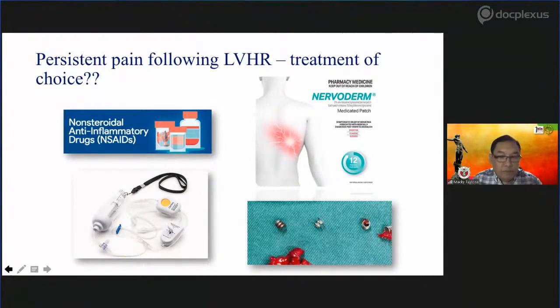One thing that we also do in our hospital is that even before distending the abdomen, or even before the induction, we sometimes use the ultrasound to mark the defect size. You may have an idea already as to how big the defect is pre-laparoscopic or pre-insufflation. So that could also help you in measuring the defect, aside from doing the measurements during your procedure.